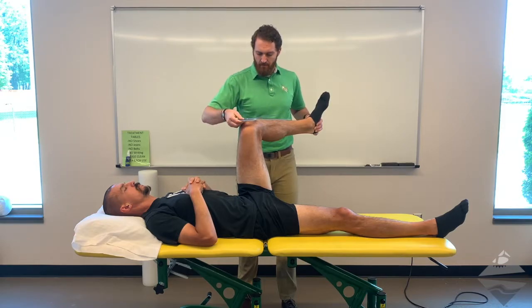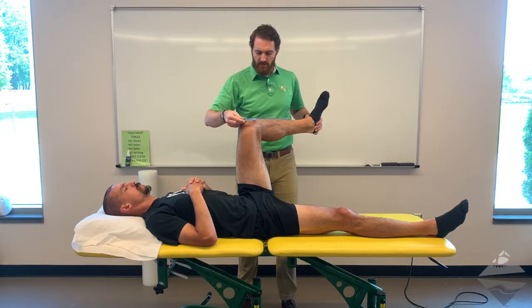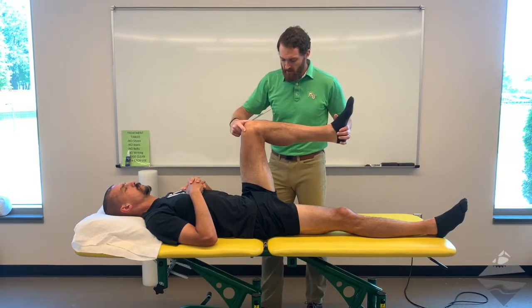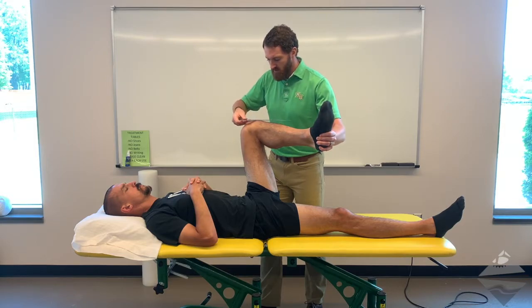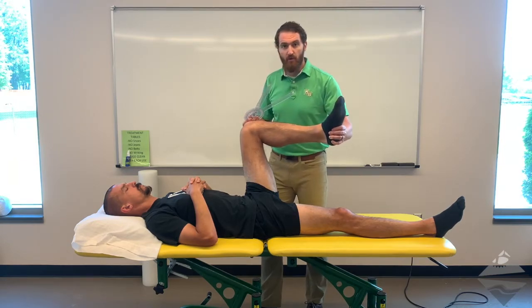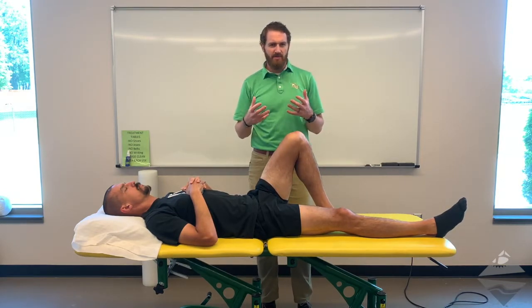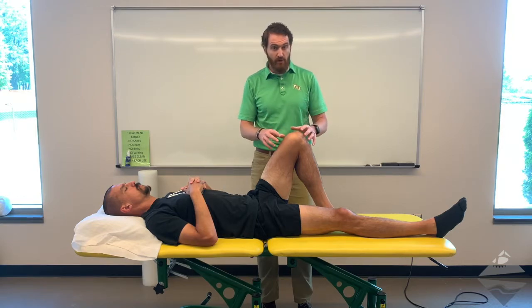We take the goniometer with the axis of rotation midline axially through the femur. The stationary arm is in the neutral position and the mobile arm follows the tibial shaft. We find 41 degrees of internal rotation of the hip. Moving to external rotation and taking the same measurement, getting good at a one-handed measurement approach is really handy. We find 45 degrees of external rotation. Typically at the hip we get around 90 degrees total arc — the normal is 80 to 90. Here we have 41 internal and 45 external, giving a total arc of 86 degrees, which is a normal arc of motion.